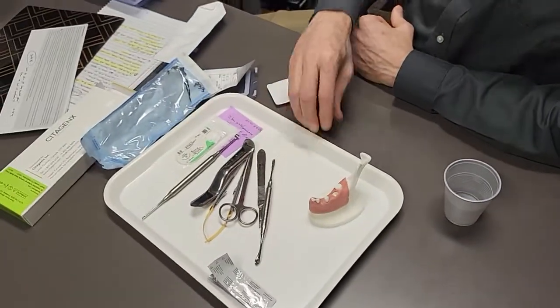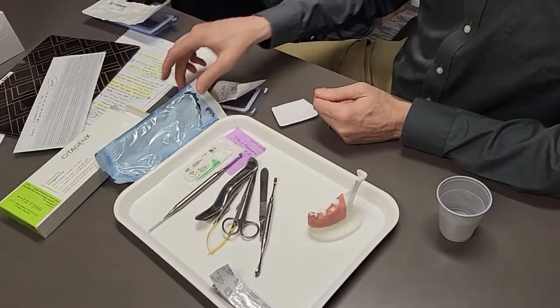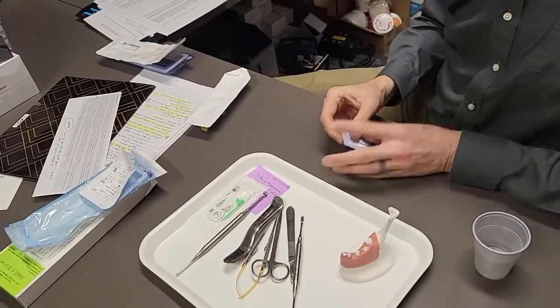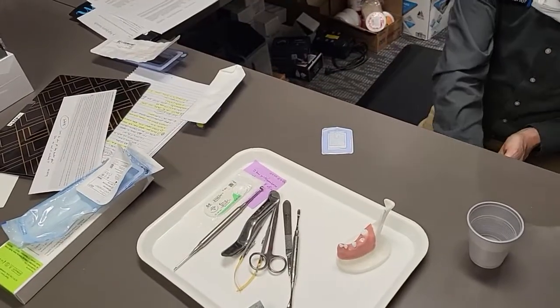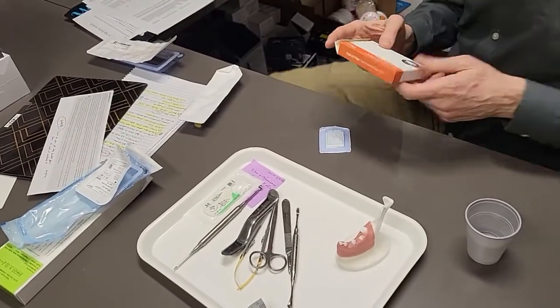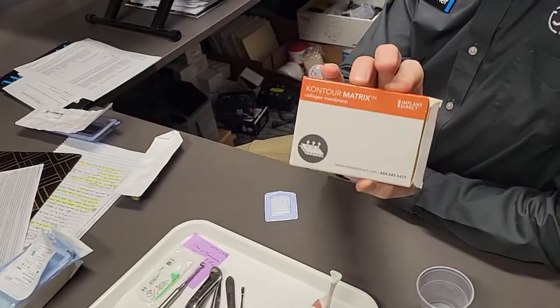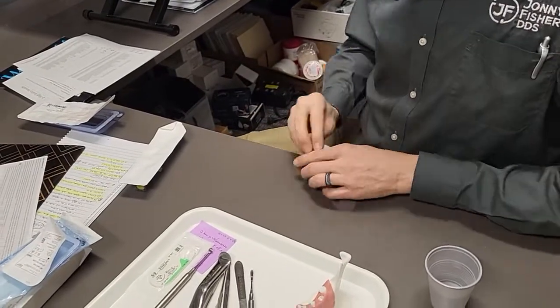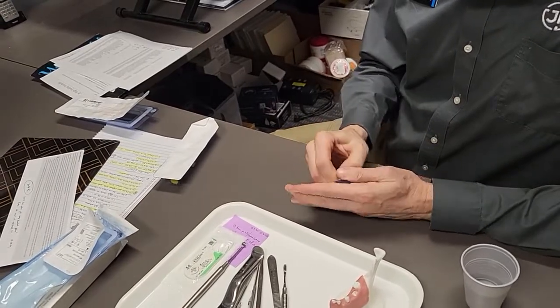If you're planning on doing bone grafting and membrane, there's a couple things you want to make sure happen at the beginning of the appointment. Number one, put the membrane in — and this membrane is a super nice flexible one called Contour Matrix. So membrane in the saline. We put the membrane in the saline, it hydrates it, makes it nice and flexible and floppy.